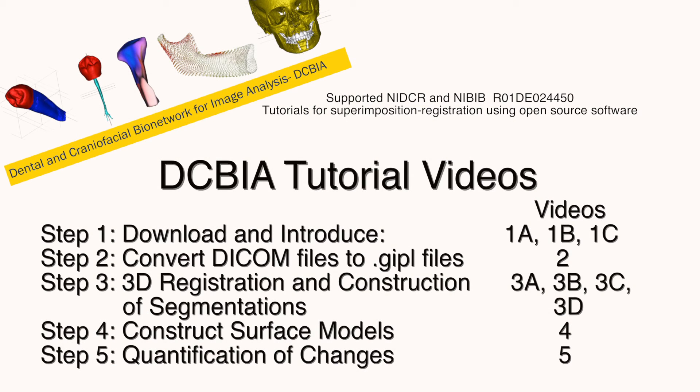These are the basics to downloading and installing ITK-SNAP.